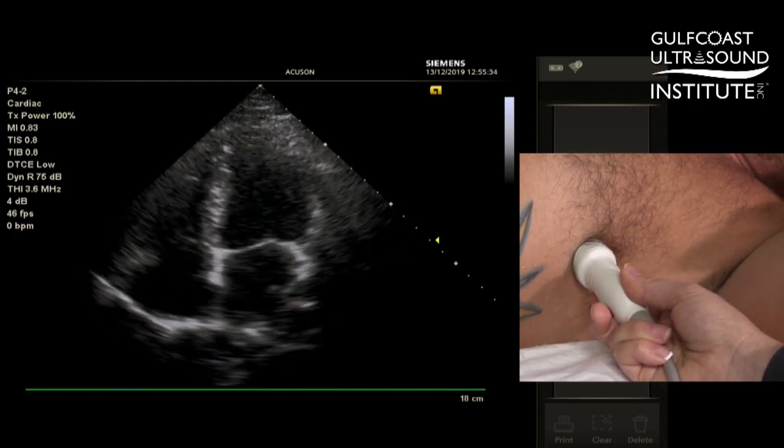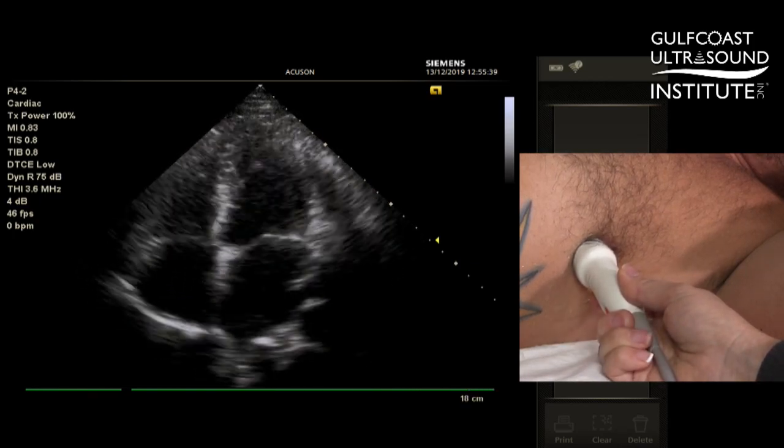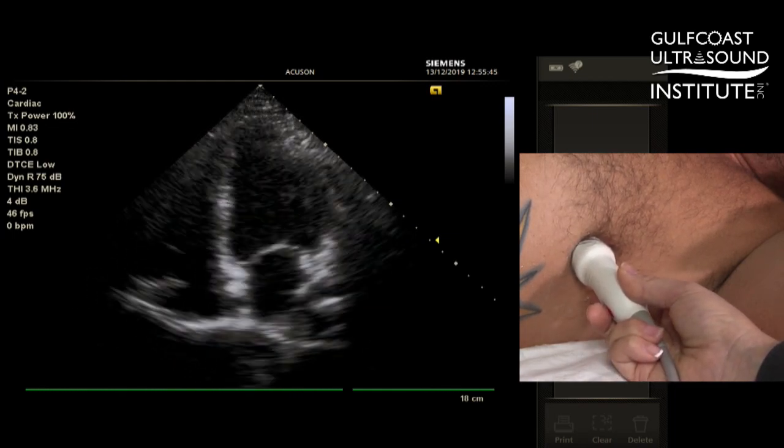Starting at the apical four-chamber view at the fourth or fifth intercostal space, making sure your beam is in line with the patient's right shoulder, we start with the apical four-chamber.